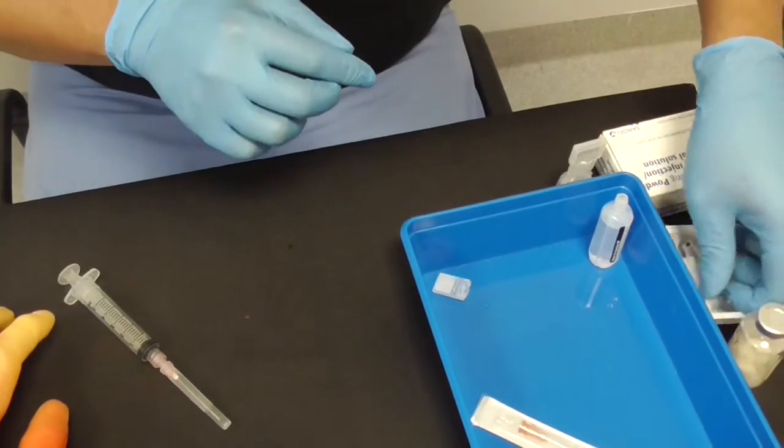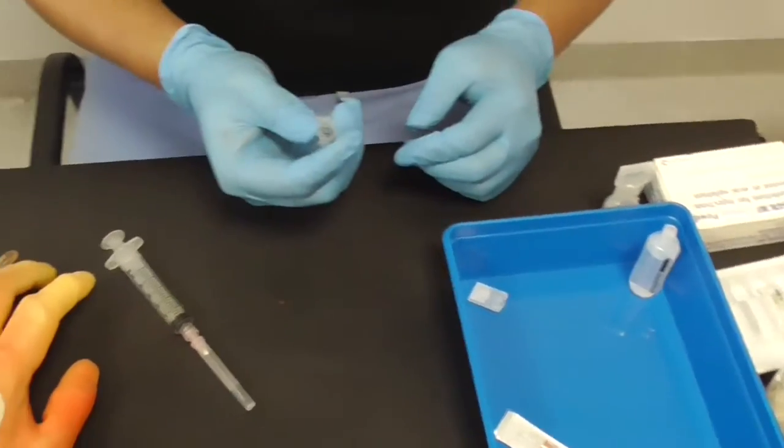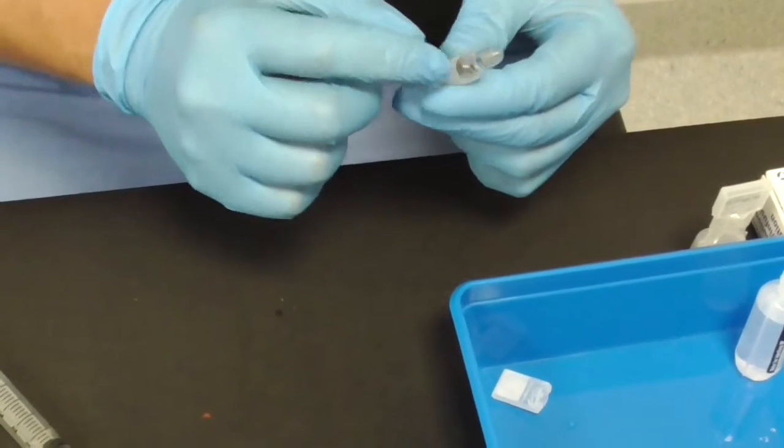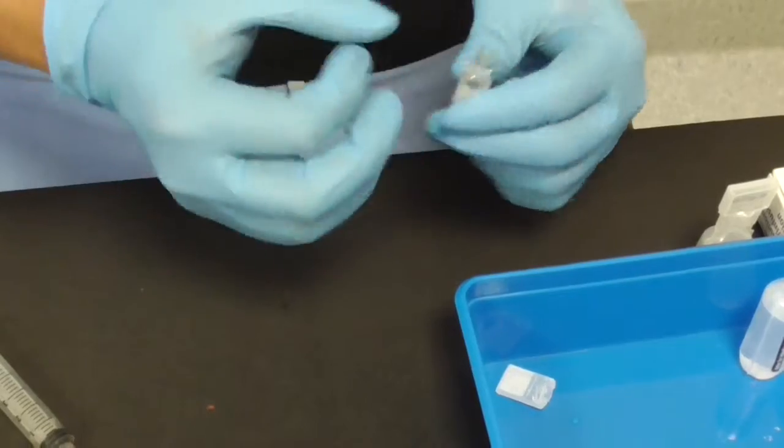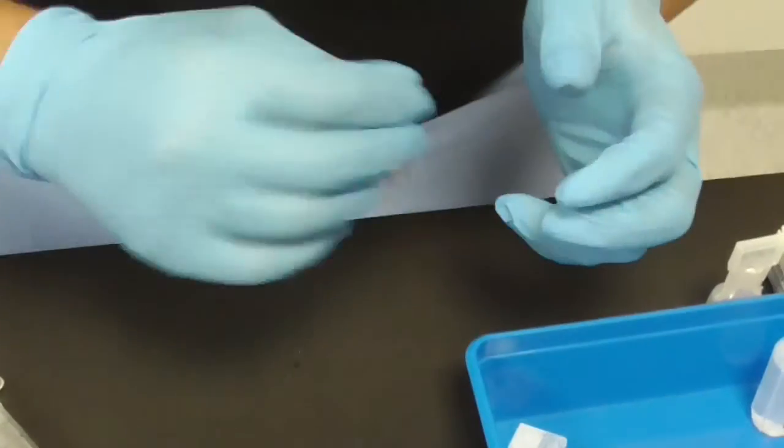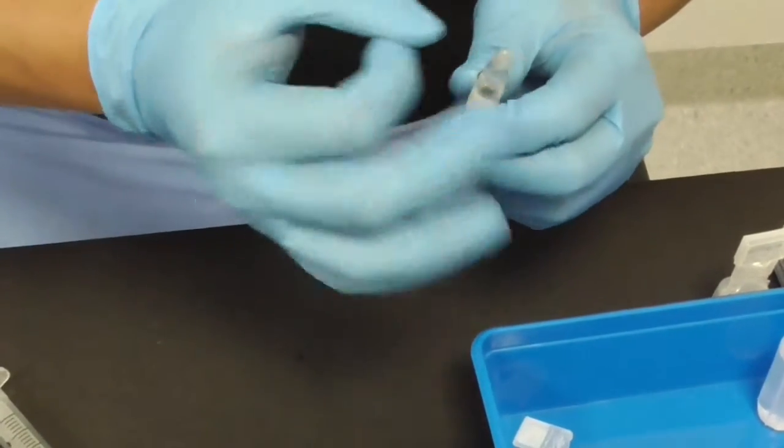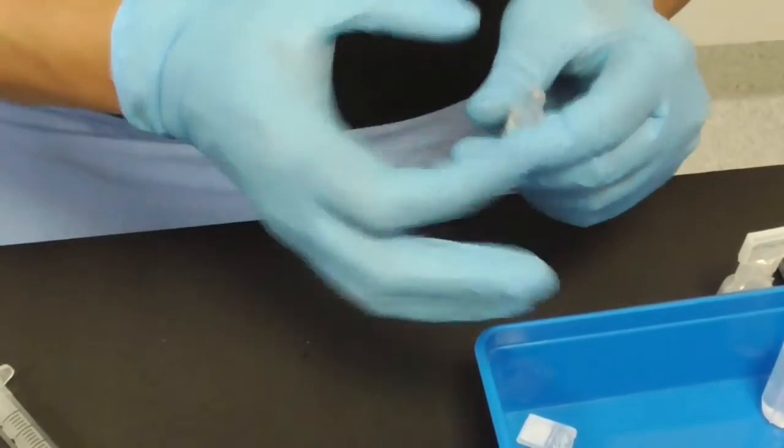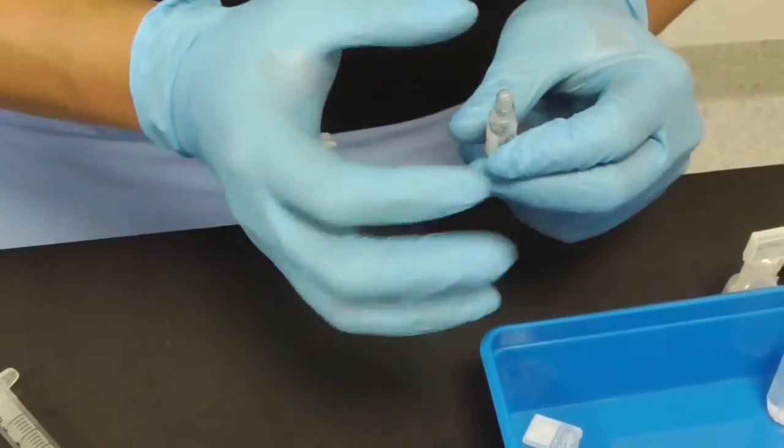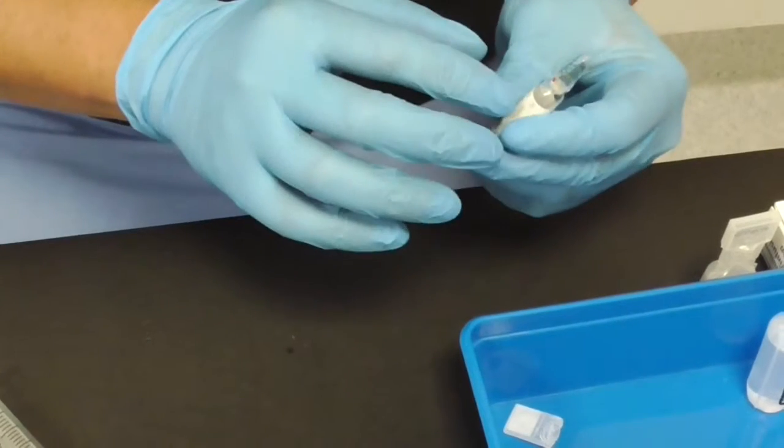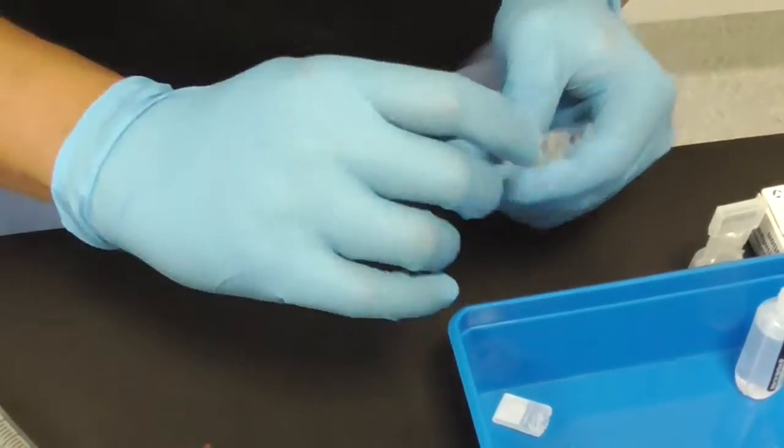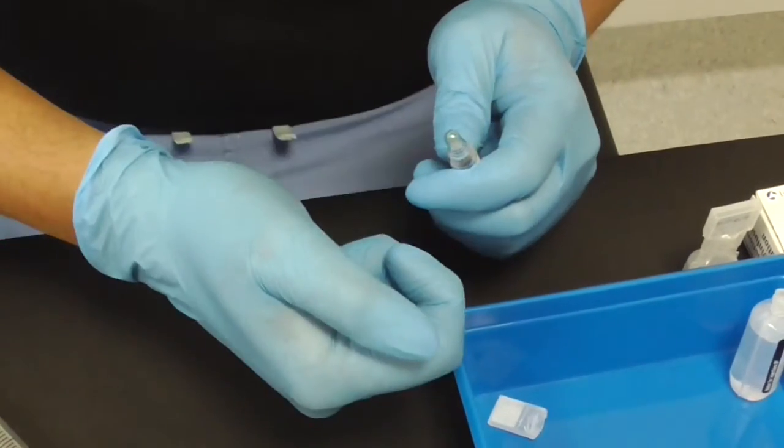Some fluids actually come in a glass bottle. If you look at the glass bottle, they always have a bit of fluid above the neck and most of it below. So you've got to shake it, tap it, so the fluid gets all into the main part of the bottle. Of course, since I'm demonstrating, it'll behave badly and take a little while to do that. And when you've got most all of it in there, you can see there's a little red dot. That's where you put pressure and snap it open.